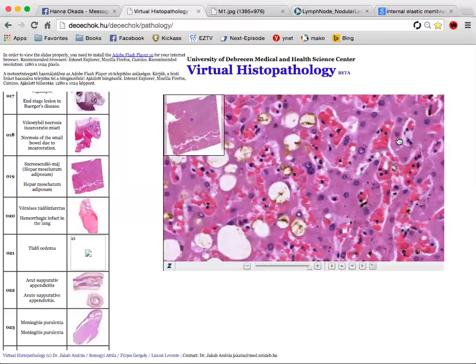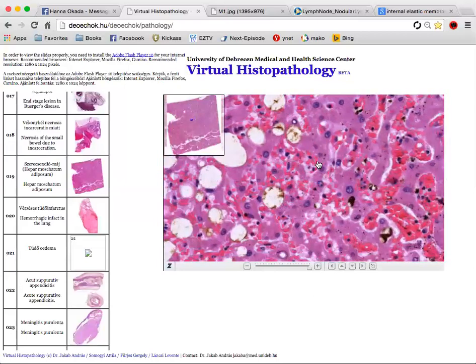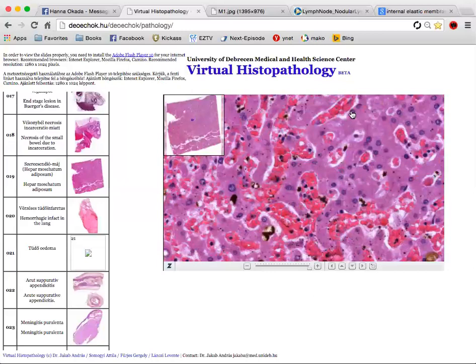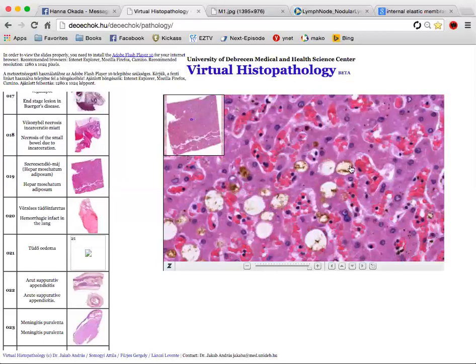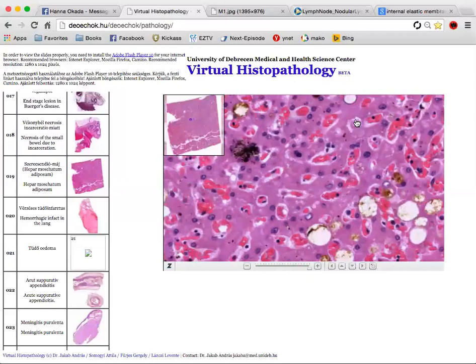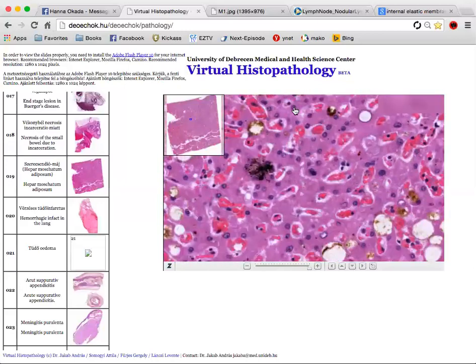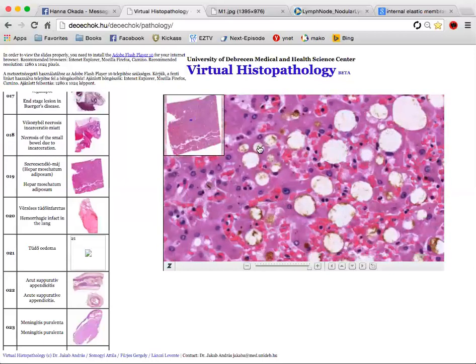So you see all this blood congested here. What's also important to see is all this brown pigment, and this is all partially digested blood, and that's this brownish color. It can be intracellular, like here, it's inside the cells. Some of it can be extracellular. So what you have to note here is all these congested sinusoids, the fatty transformation here, and the partially digested blood.